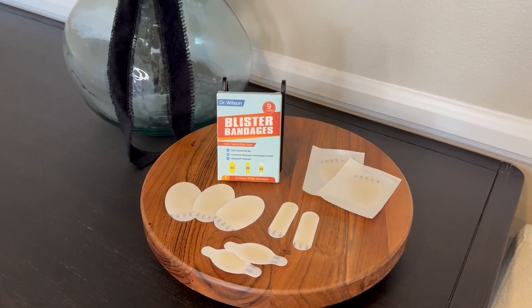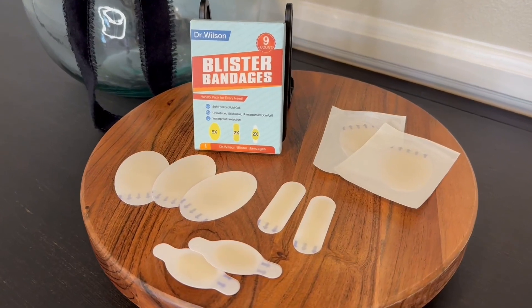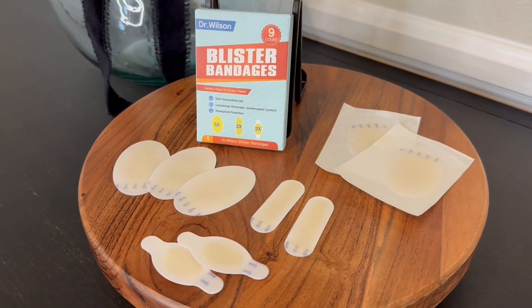Hi folks, this is Heather and today I'm here with an up-close look at these blister bandages, which I received in exchange for my honest review. I'm going to tell you about their features, show you them up close, and hopefully this will help you make your decision.